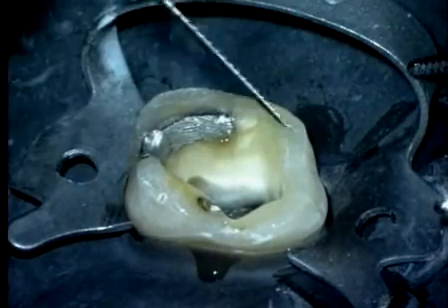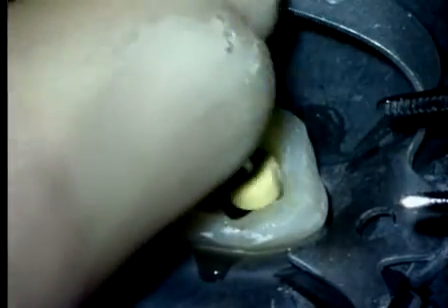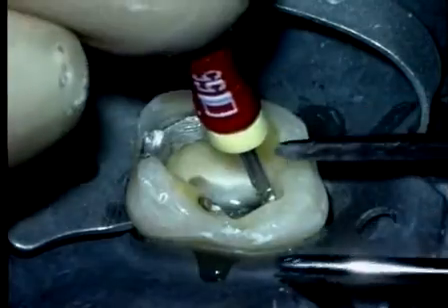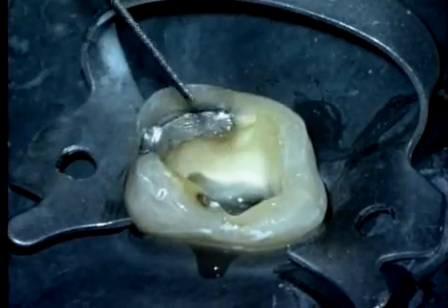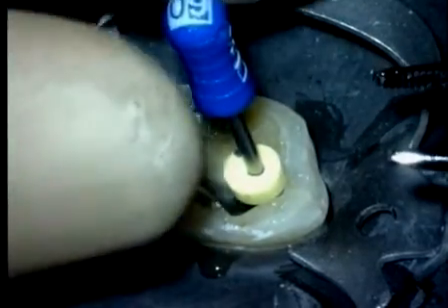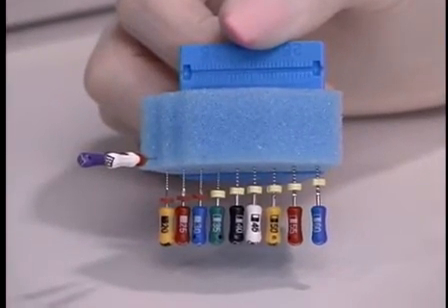To confirm deep shape, we proceed on through the series of hand files. Deep shape is confirmed when each larger sequential instrument is observed to progressively and uniformly back out of the canal. Deep shape creates a more effective reservoir of irrigant and provides the resistance form to hold gutta percha during three-dimensional obturation. The 60 is the last instrument used. The 60 will usually be within about 3, 4, or 5 millimeters of length. A quick way to check your shape is to have the assistant show you the rubber stops and look at the relationship from one stop to the other.